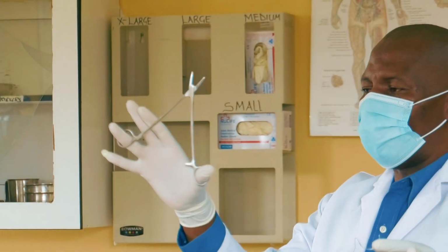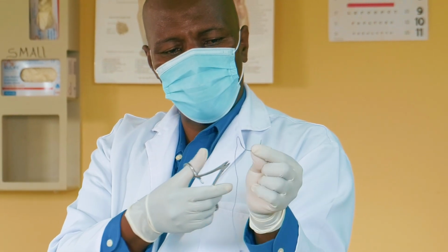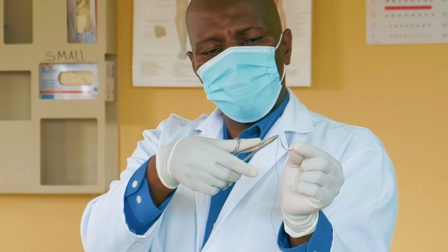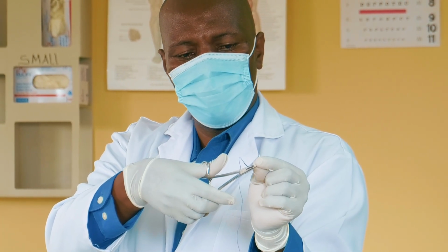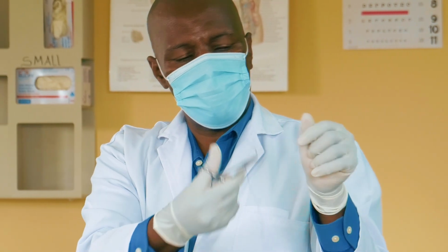When we are mounting this here, we divide the needle into thirds. Where I'm holding is the first, the middle part is the second, and the last part is here. Where the first third is ending, that's where I'll clamp, so that I have enough that should go through the tissue of the patient. Again, it's just the tip that should go here.